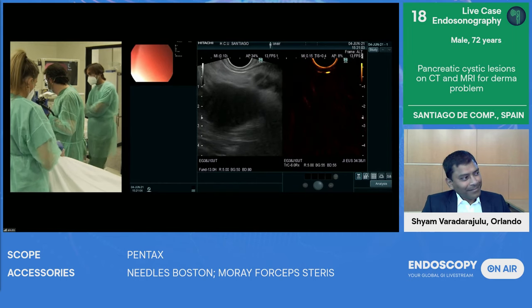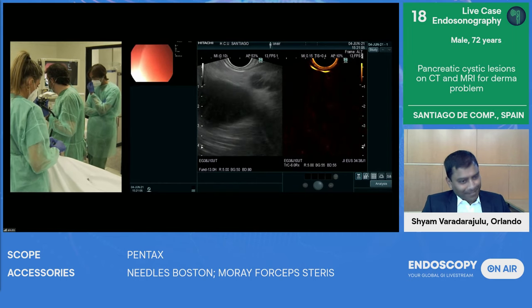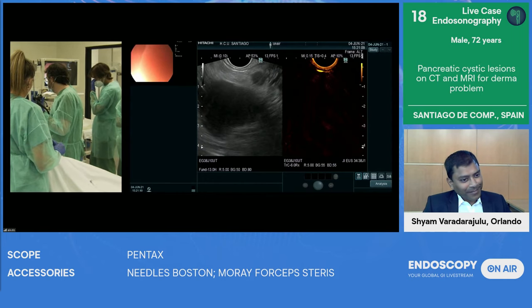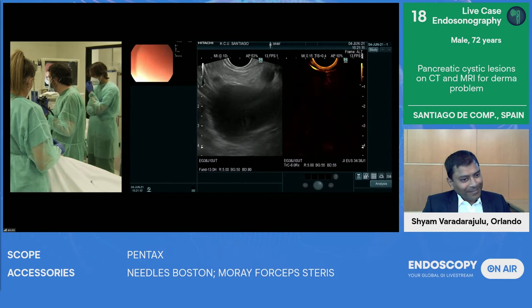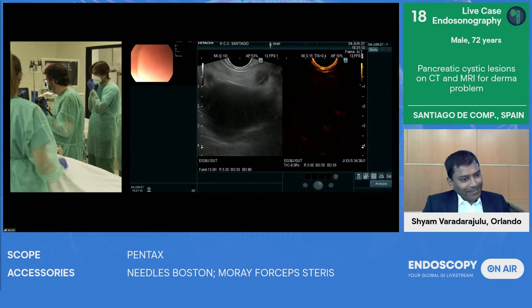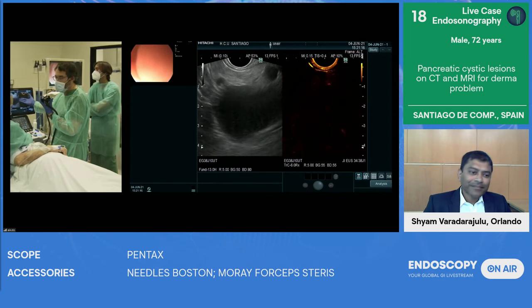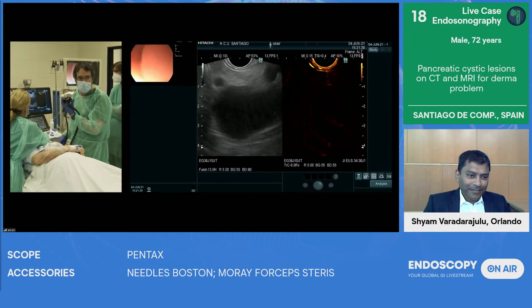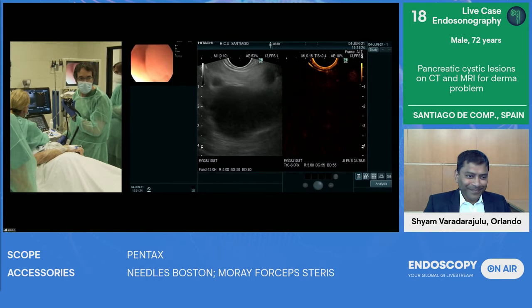So very important, we need to decrease the focus to the distal part, to avoid any interference. And I can tell you that in the MRI, there was a suspicion of an enlarged wall. So although I don't believe with a B-mode image that there is nothing in the wall, I am very confident on giving contrast. And of course, I love to play and get videos of these very nice cases.